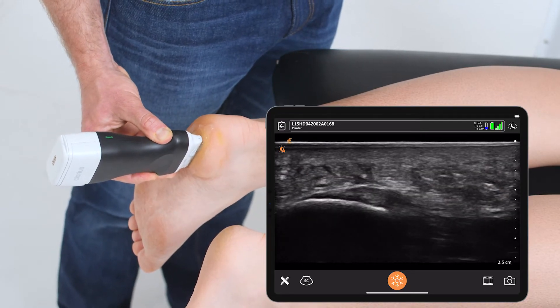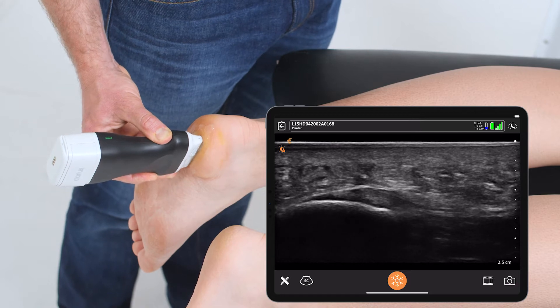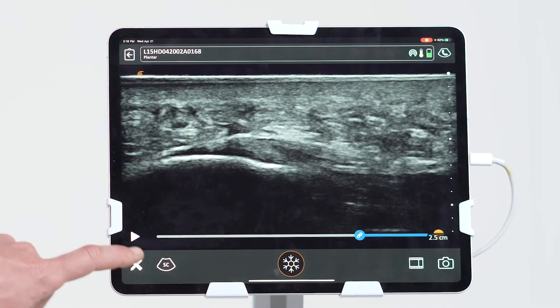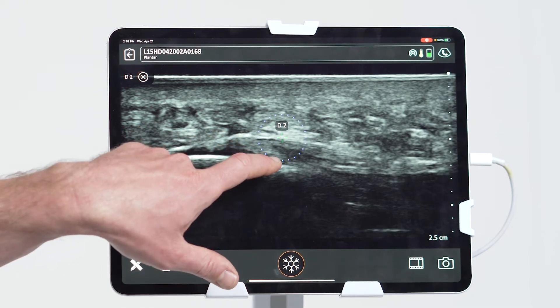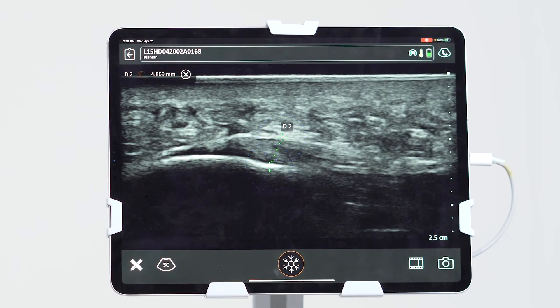Here we can quickly and easily see the plantar fascia pop into view. I can take a quick freeze and drop calipers on to measure the thickest aspect of that fascia — well below what we worry about for plantar fasciitis.